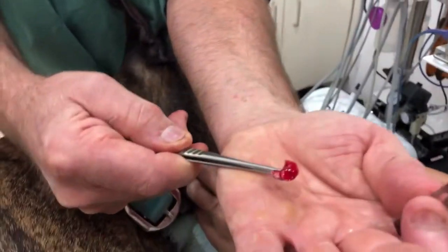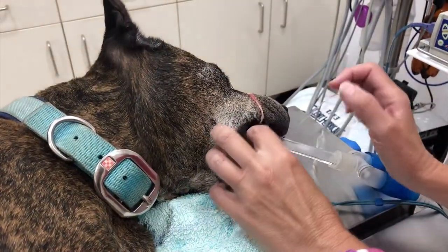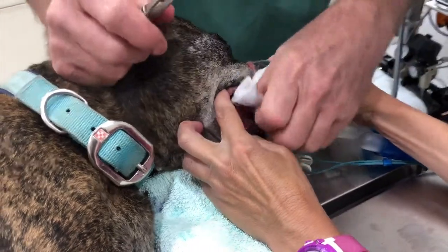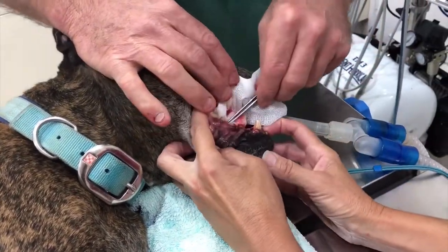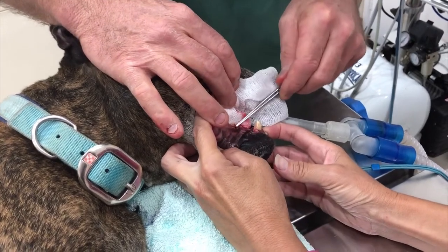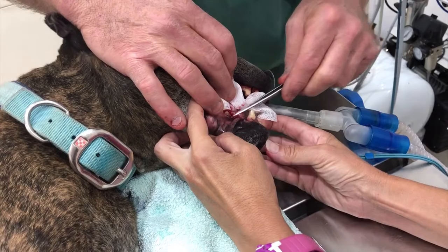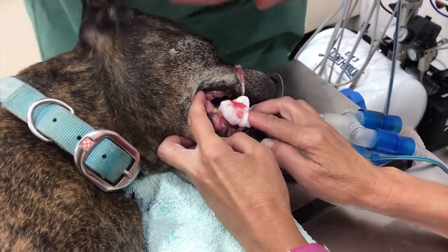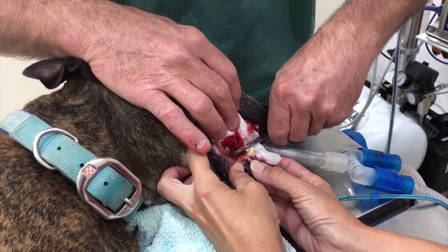Have a look — it's just warty, fleshy tissue. Open your dog's mouth regularly and have a look at what's going on. We'll clean these teeth up as well, but the epulis is now gone. Gum bleeds like crazy, so that's okay — it'll stop in a sec. We'll put some pressure on that and just cut a little bit more away here.